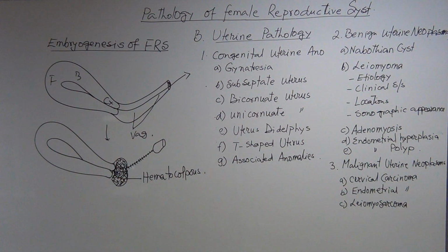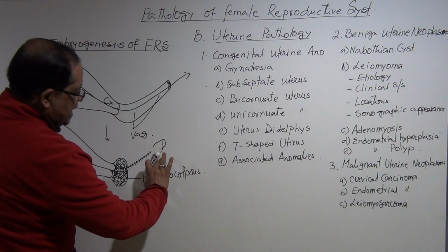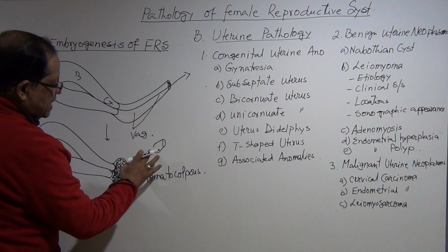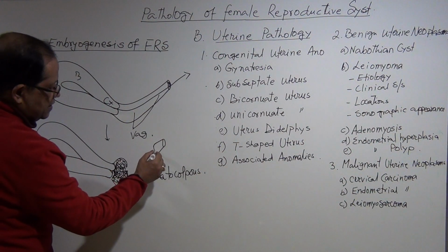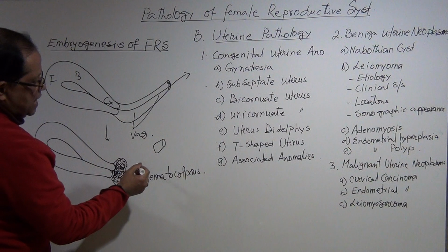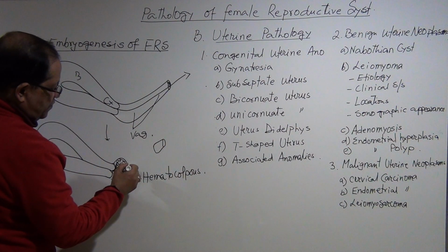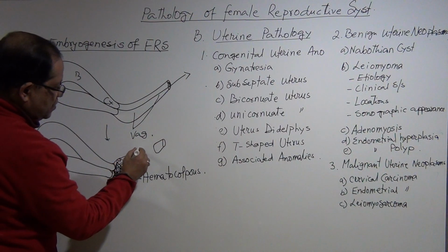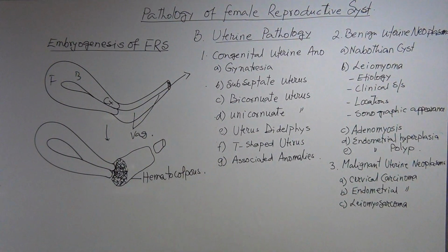Hematocolpos. And if only here there is a disconnect and the rest of this part is present and the bottom part and there is a continuation of this.